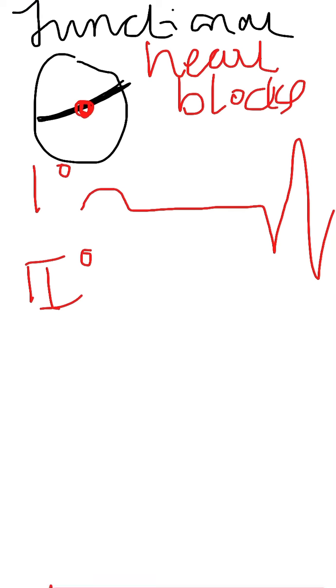So what you're going to see is a P wave segment, all right, and then you'll see the QRS, and then you'll see the T. Then it will continue, and then you have a P, and might have another P, and even a second P, and then that's when you see a segment. And you will notice that in this case there's actually no QRS happening here.